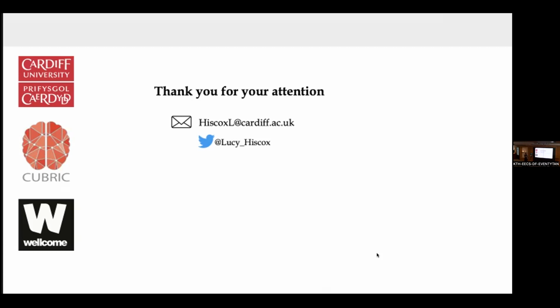Functional MRE is used more now. You would use it if you were looking at similar tasks in fMRI. I don't know too much about it because it is fundamentally a different technique. Yeah, but supposedly it is 60 times faster than the BOLD signal. The changes in tissue mechanics, with a visual stimulus, you can detect exactly changes in the occipital lobe.